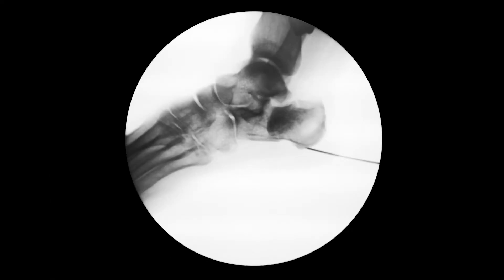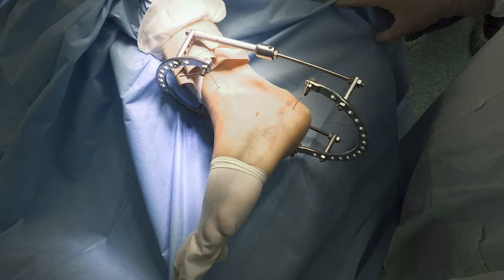At the first step we installed a distraction device based on two wires and achieved traction. You can see a large empty space in the subtalar joint area.